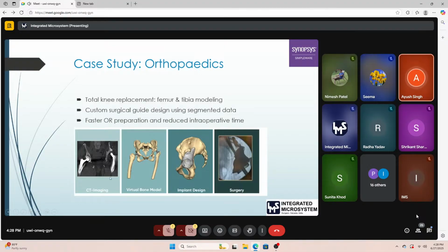You can check the accuracy of my wording on the Synopsys Simpleware website. They have listed all the data sets and published them directly, so the details that I mentioned can be cross-verified there. Then once this virtual model was done, all the pre-existing implants were identified.